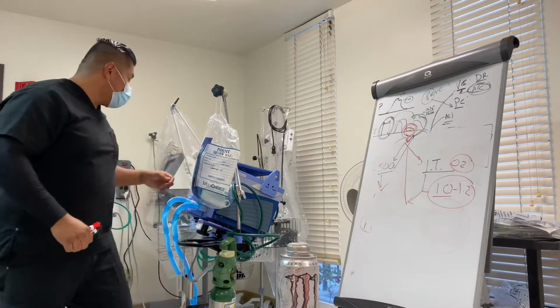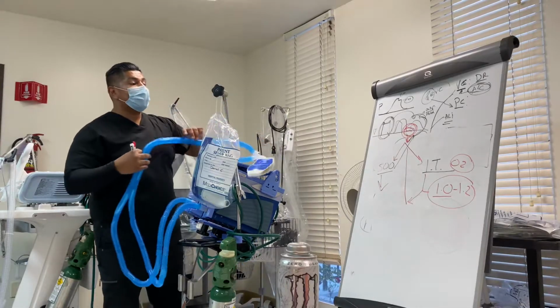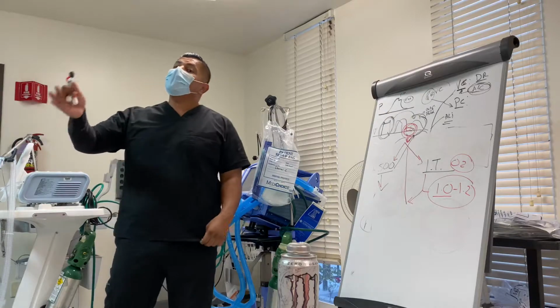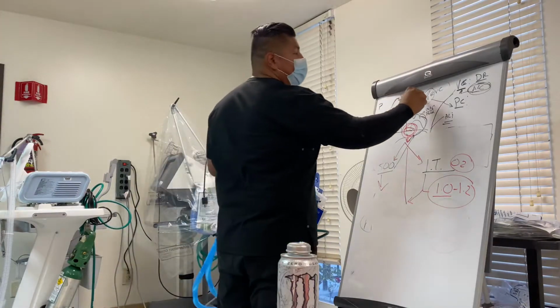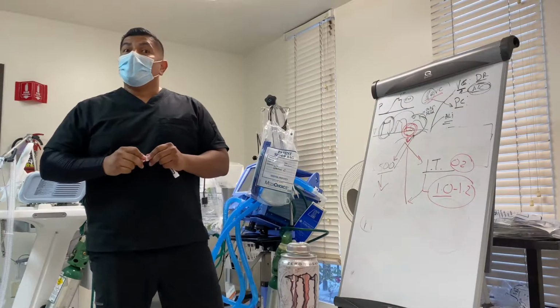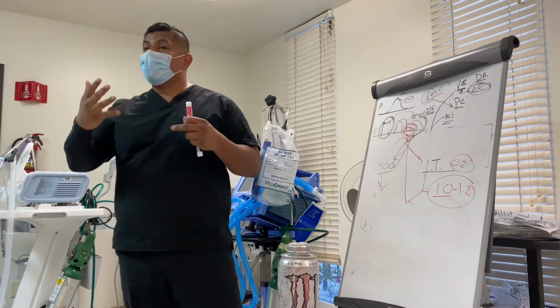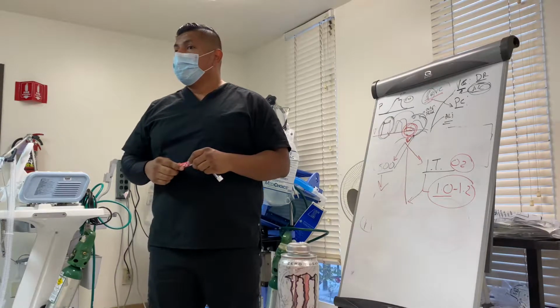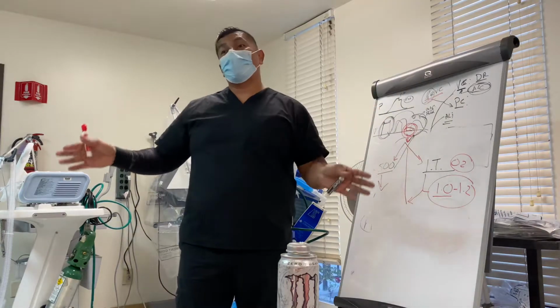Because on an adult, depending on the size of the adult, you will not give that adult enough time to achieve that tidal volume. Much less hold, much less alveolar recruitment. Remember, the whole purpose of PRVC is to minimize micro damage. If you deliver I times at 0.5, the flow is so turbulent, you are causing nothing but damage. Now, whether the patient tolerates this or not is a different story.